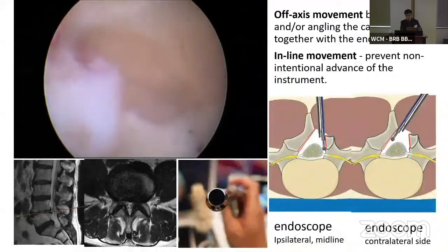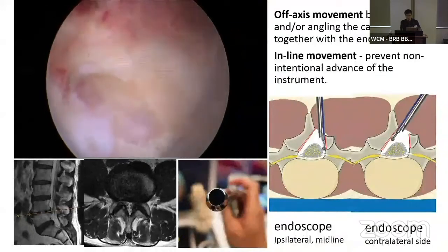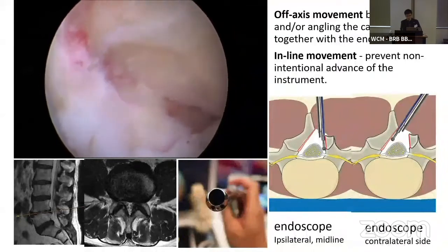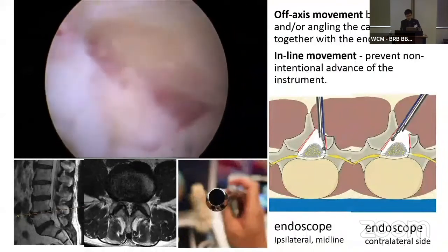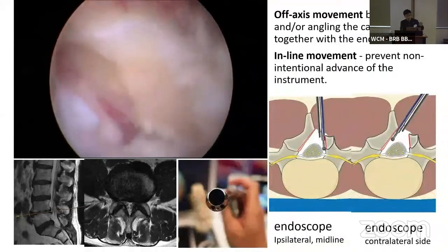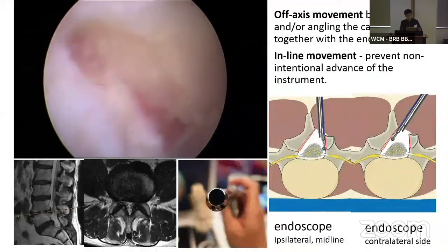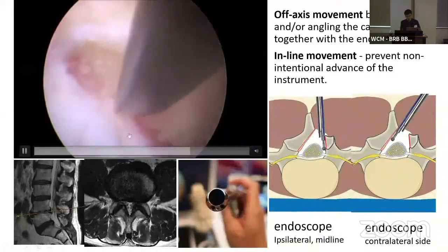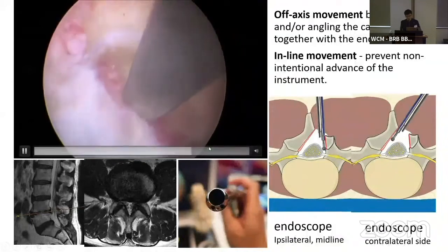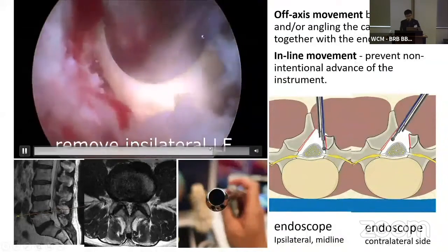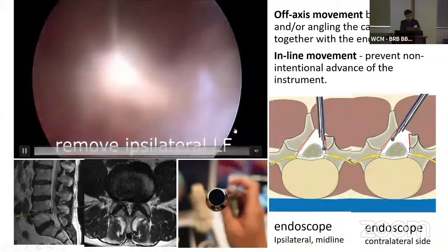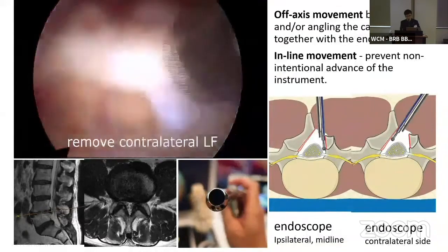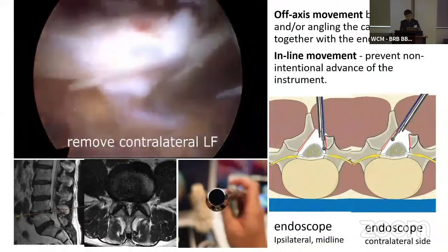And eventually we can decompress the contralateral lateral recess as well. Because the optics are 25 degrees and the surgeon's eyes are already inside the spinal canal, we can see the decompressed end margin of the lamina very well. And then we can make complete decompression of the ligamentum flavum by removing it in one piece — like an envelope section.